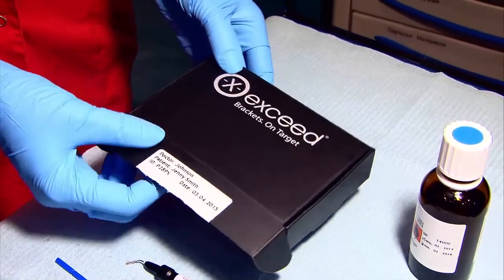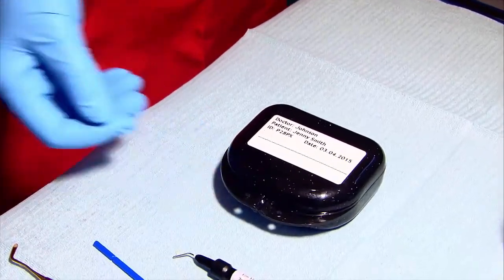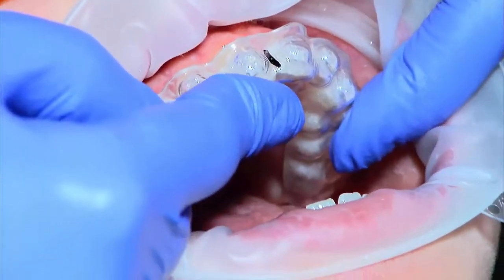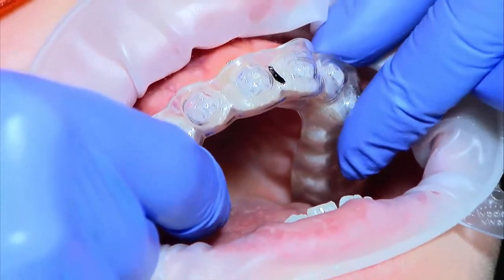Along with setting up all the necessary chair-side materials, it is always helpful to prepare the trays in advance before the patient is escorted to the chair. In complex or severely crowded cases, the trays may be fitted in the patient's mouth prior to preparation to plan the insertion path.